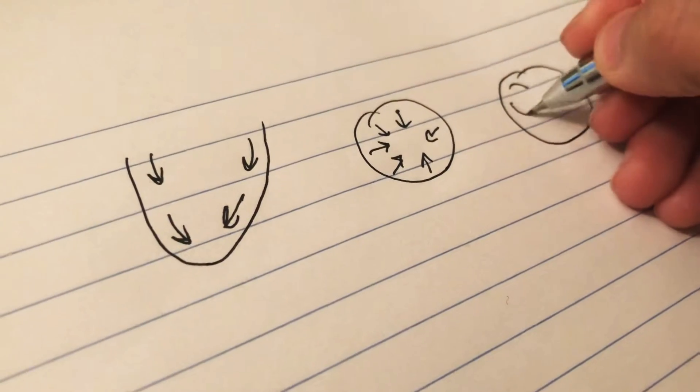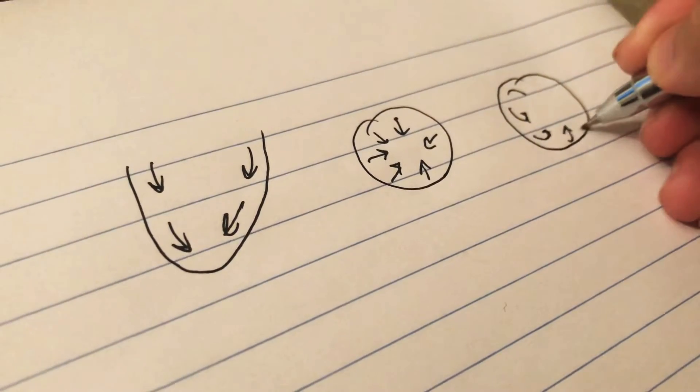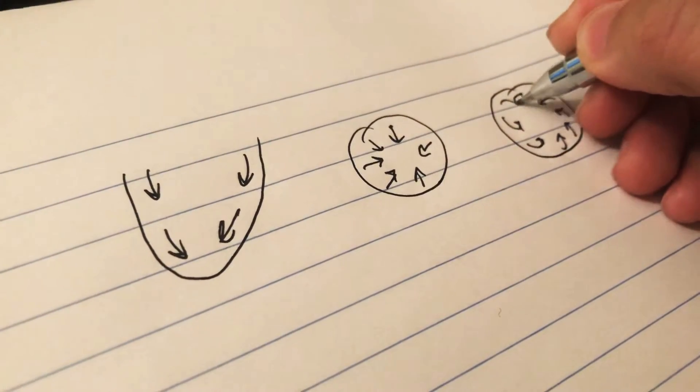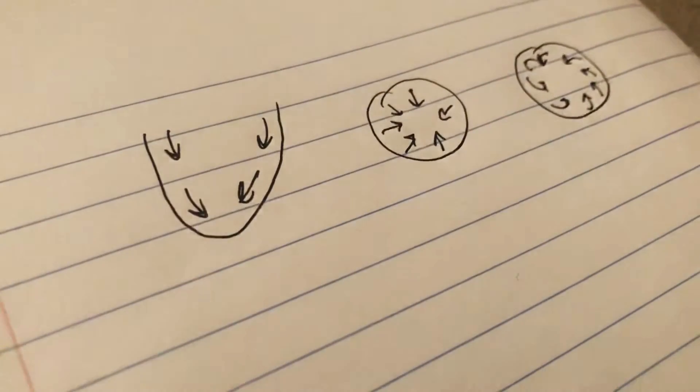So in that case, the ventricle contracts in a ringing fashion. So there are three ways that the ventricle contracts.